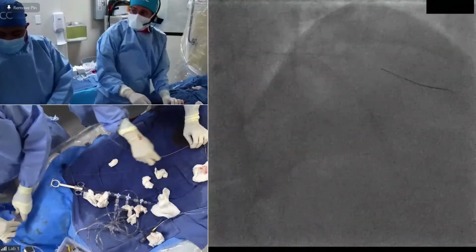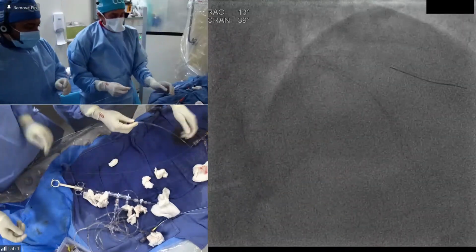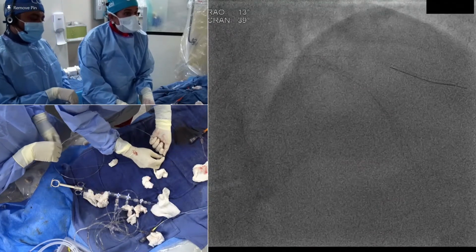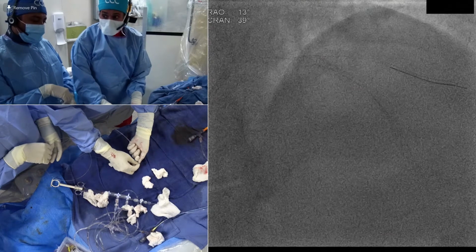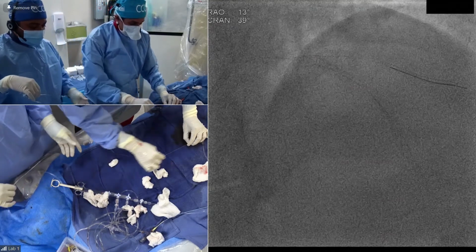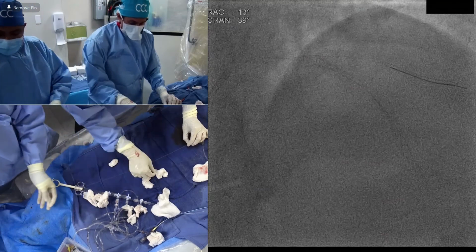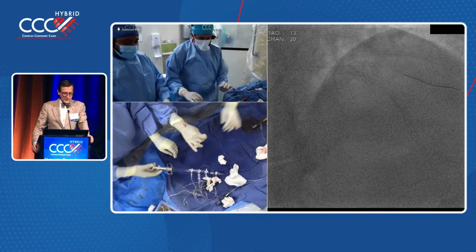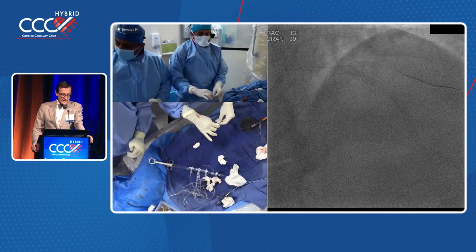Okay, apparently they're ready in some other room. So what I'm going to do here is a final kiss, and then I think we will be done here. You guys want to move to the other room? Let's thank Dr. Kini and Dr. Parasuram, who are doing a great job over there in this room with a CTO, reverse crush, and all these things.